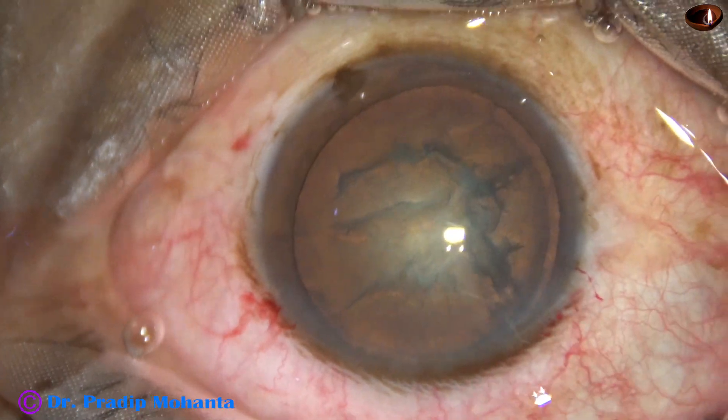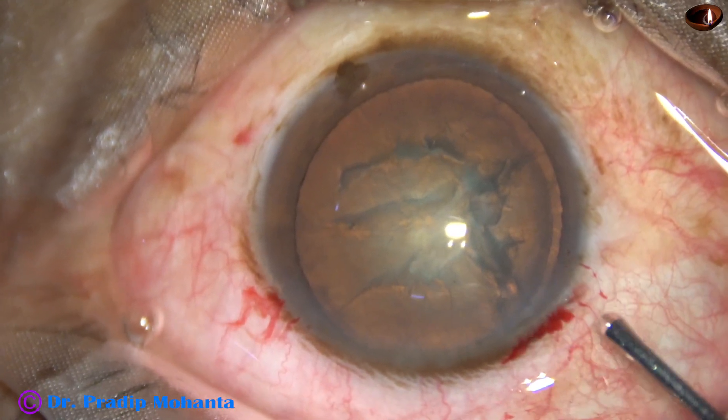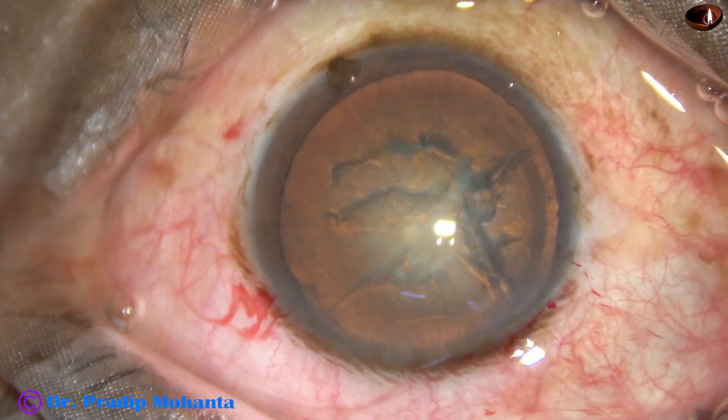The nucleus is tapped and rotated. OVD is again used to fill the anterior chamber.